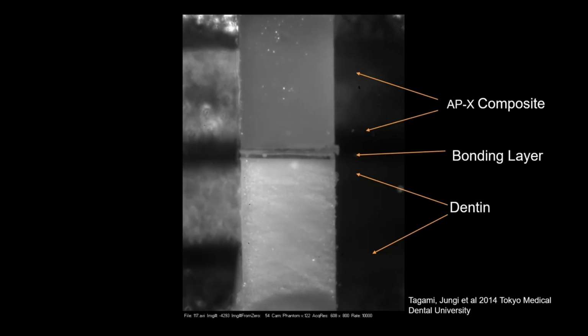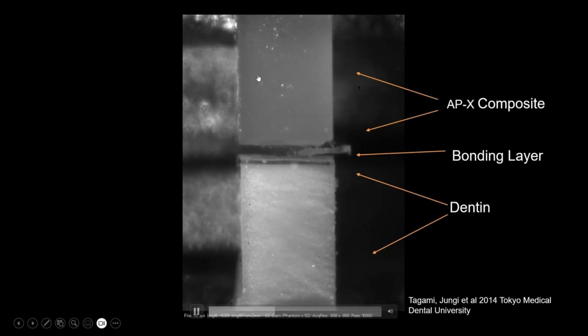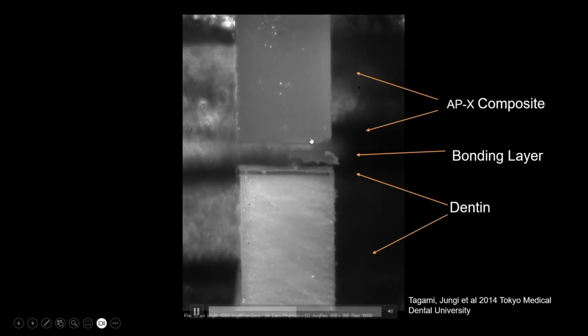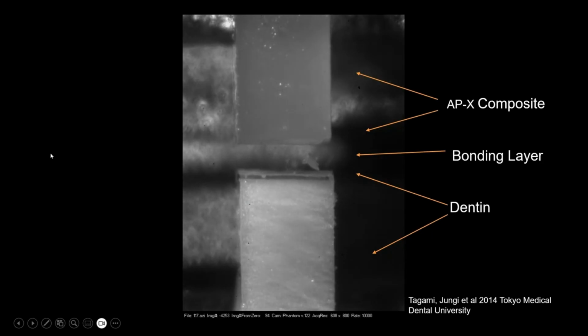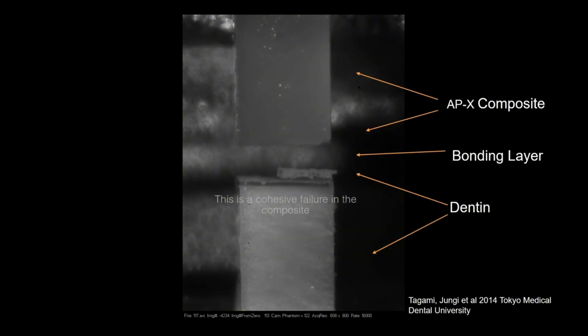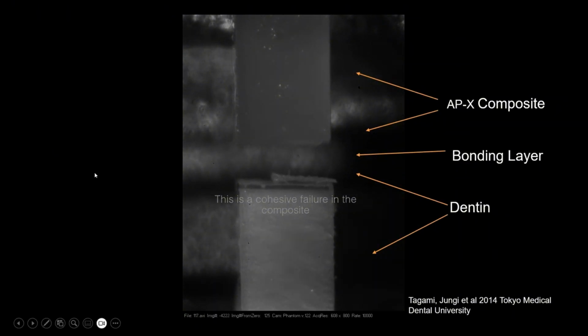So watch really, really closely. This is in slow motion. Look where it's breaking. Here's the dentin down here. There's the bonding agent. It actually had a cohesive failure in the composite. The bond was so strong that it broke the composite. Your patient's not going to have any pain from this because you've completely sealed off the dentin layer.